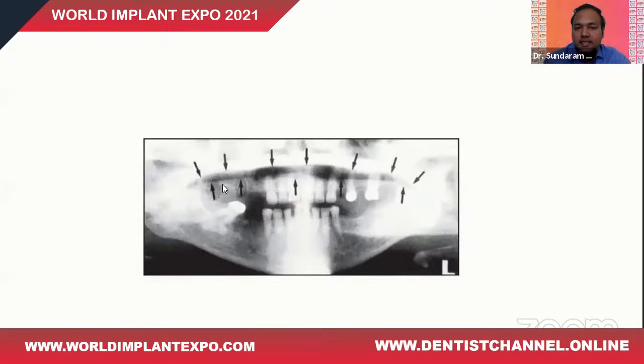Now, what is this hazy radiolucent structure present over there? That would be the tongue space. So whenever a patient is not sticking the tongue towards the palate, then such an image would happen.